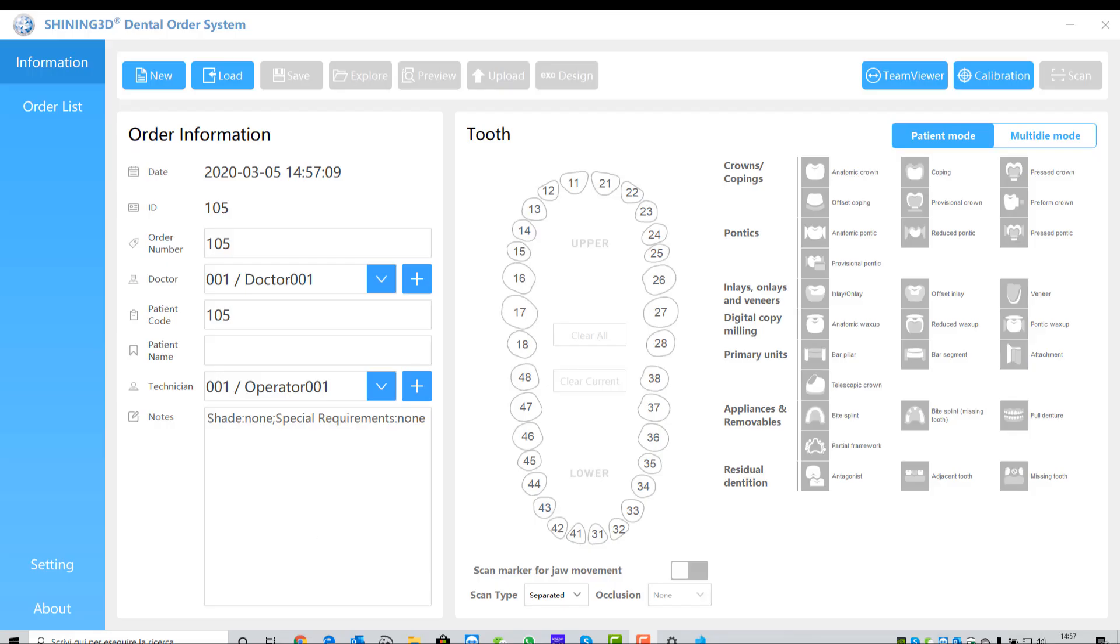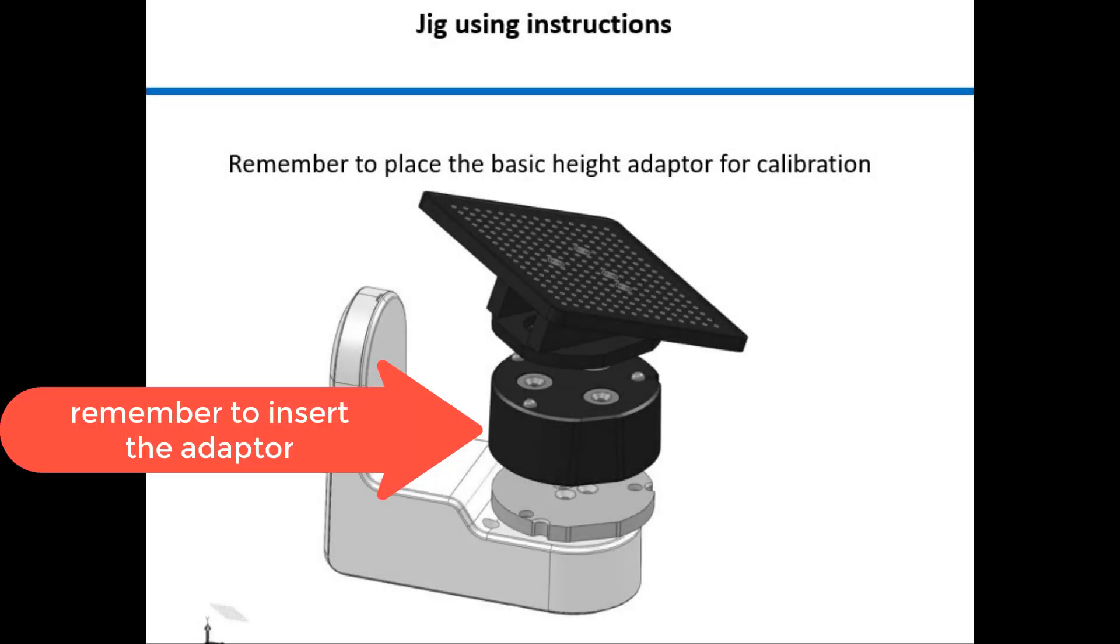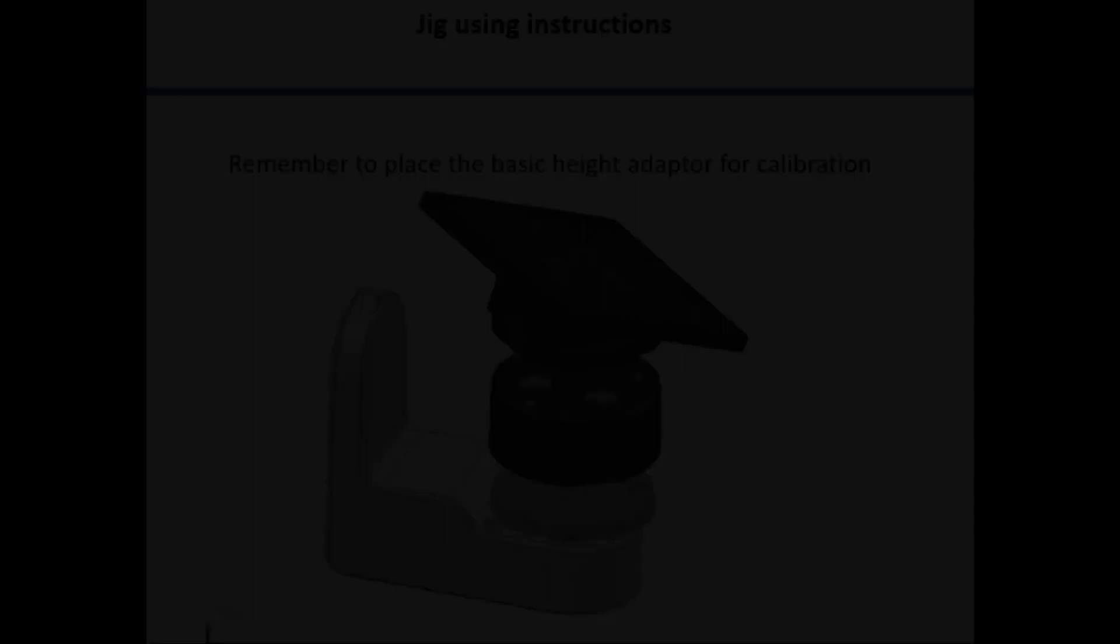Now we can open the dental manager software and press the calibration button. Remember to insert the height adaptor tool in order to complete the calibration process successfully.